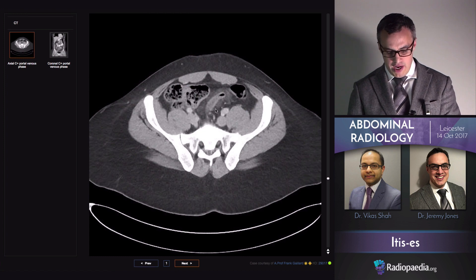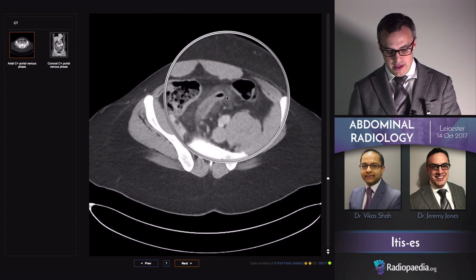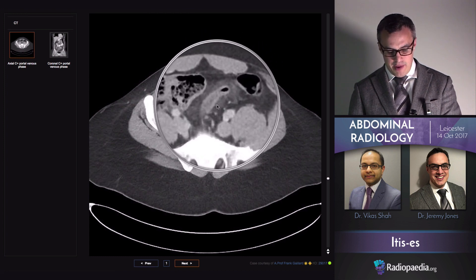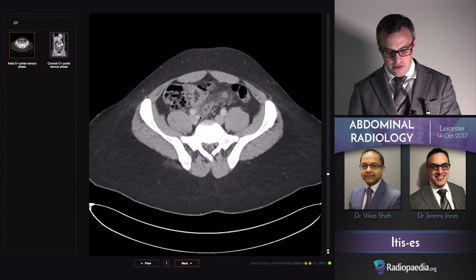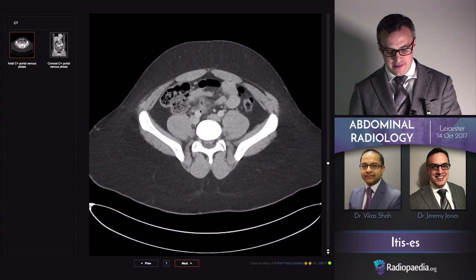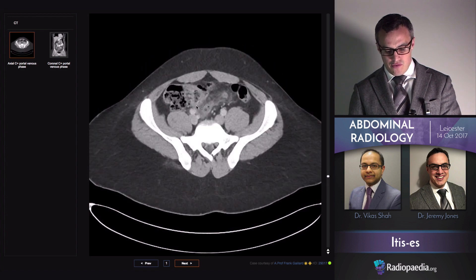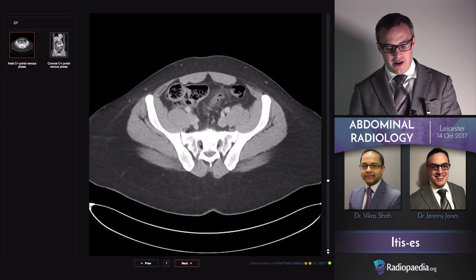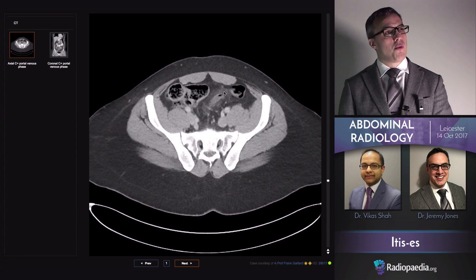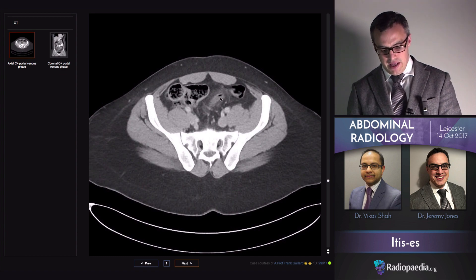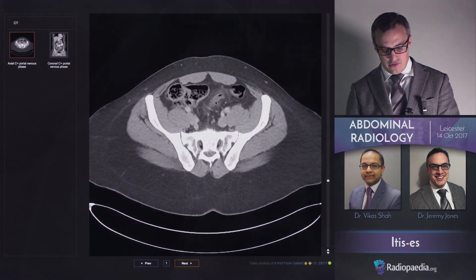This is the case we saw earlier on with the example of dirty fat. This appendix we can follow all the way back to the base of the caecum, but it extends right the way across the midline, which is probably not what we typically see of appendixes in textbooks.